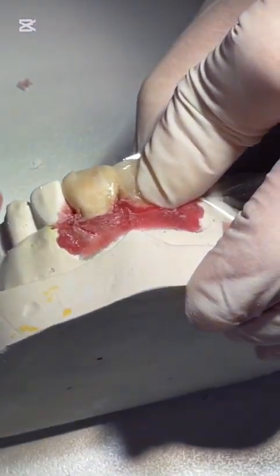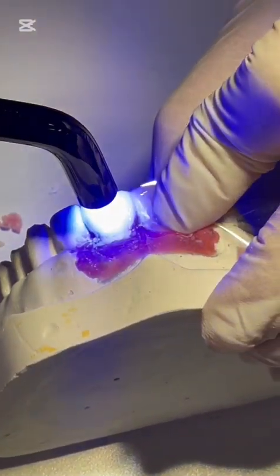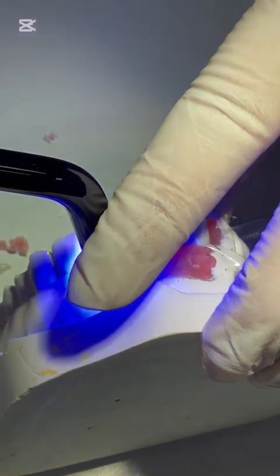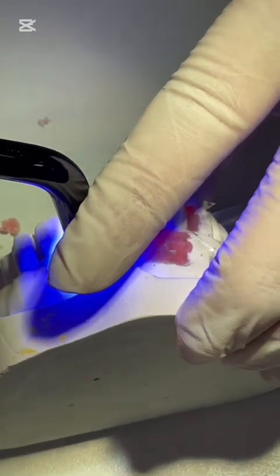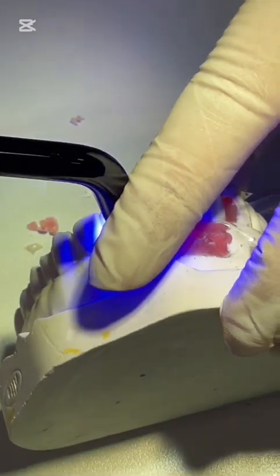Okay, light cure. Now I want to show you something. Now we just increase the width, and you will see how ugly the tooth looks if it is very wide. That's why we should keep the proportions.